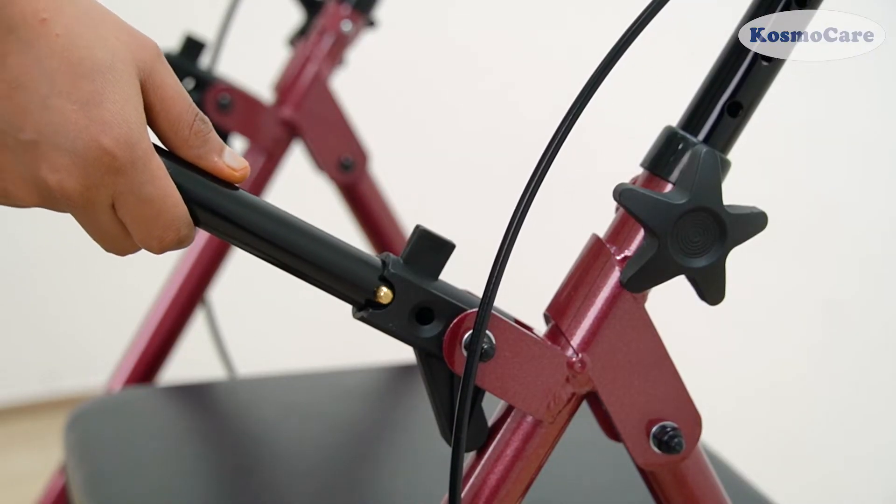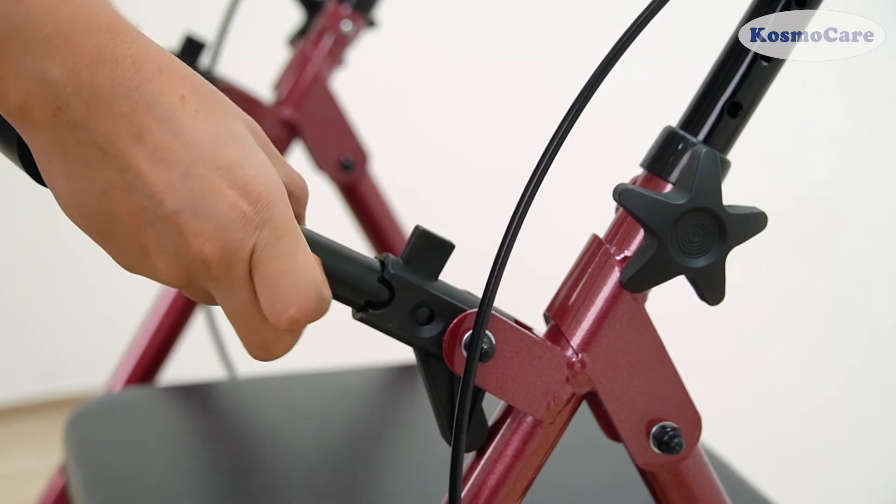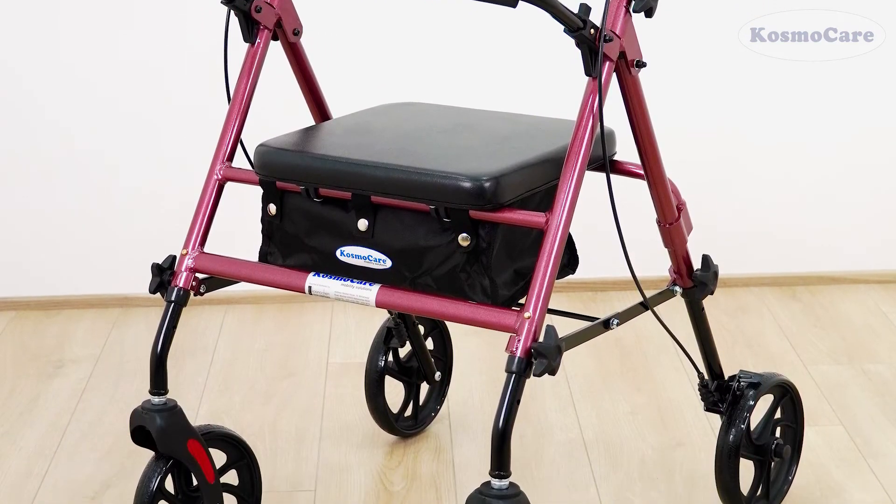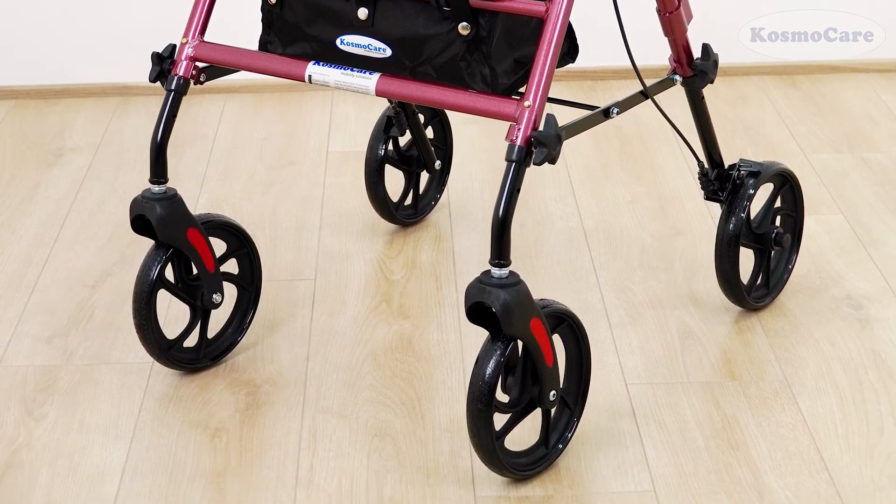Attach the padded backrest by depressing the push pins and sliding into the bracket, and your Cosmo Care Rollator Walker with seat is now completely assembled and ready for use.